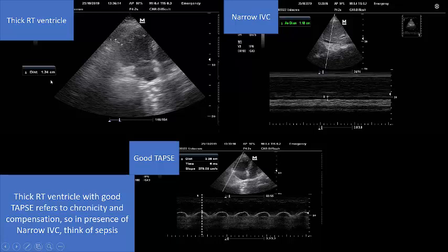In our patient, the right ventricular wall is thick — more than 0.5 cm; it measures 1.3 cm. We also assess right ventricular function: our patient's TAPSE is 2.2 cm, which is more than 1.7 cm, indicating good function. This means that despite the dilated right ventricle, it has good contractile function — indicating the right ventricle has been dilated over a long time and had the opportunity to compensate for the pressure overload by increasing wall thickness and maintaining function.